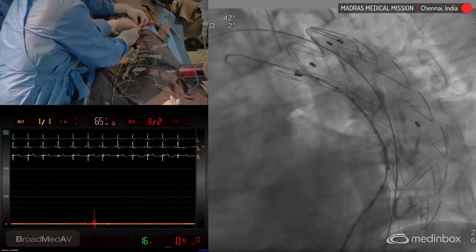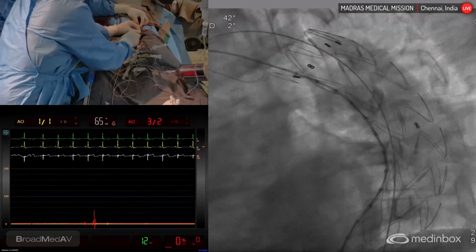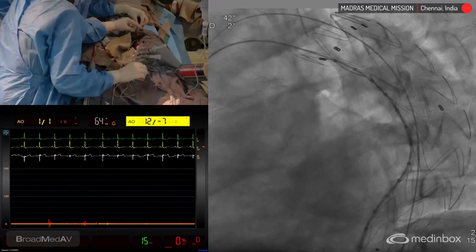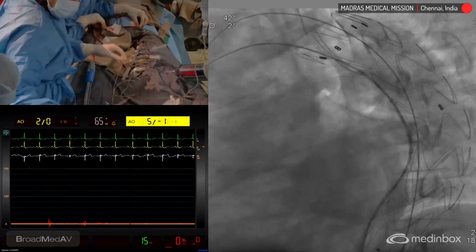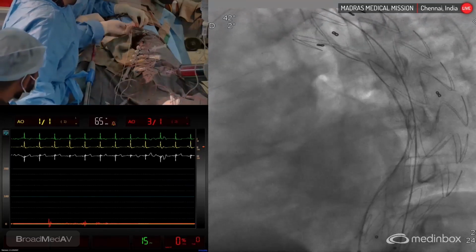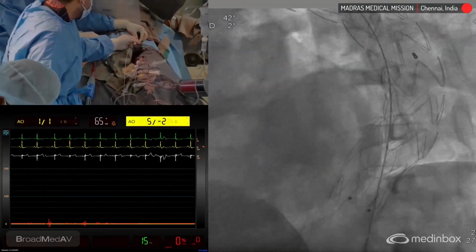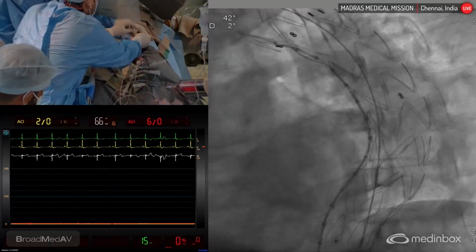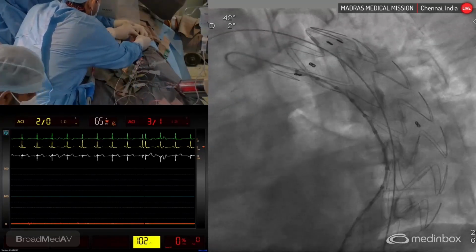Okay, in the meantime, while Ashish is recrossing through the device, there are some questions we can see. I will read the question. What is the success rate of the recommended procedure? I hope the recommended procedure here means it is a TEVAR for this aneurysm, saccular aneurysm. So procedural success, I think they're asking. What do you think, sir? What is a procedural success?